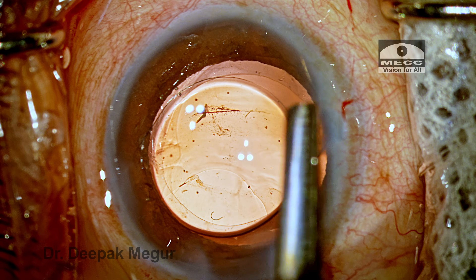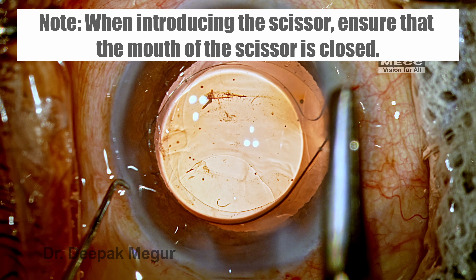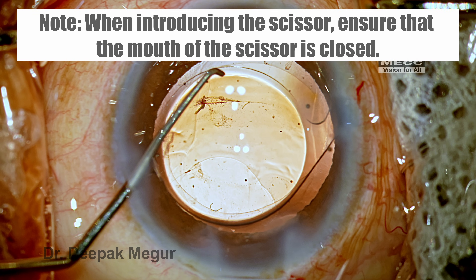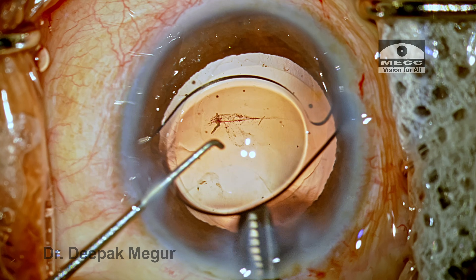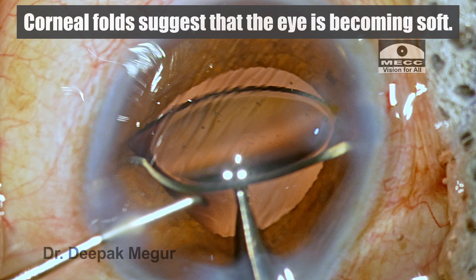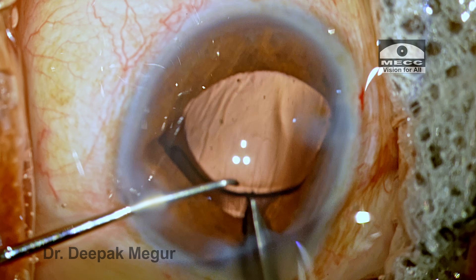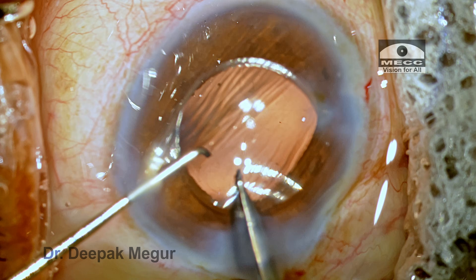When introducing the scissors into the eye, it's important that they are closed on entry to prevent the lens from jumping. The lens is stabilized with the second instrument, and once the scissors are in the anterior chamber, the mouth opens to engage the optic. What is strikingly visible here is multiple corneal folds, suggesting the eye has become a little softer — the OVD has probably escaped and the chamber is shallow. It would not be wise to proceed with cutting under these conditions.